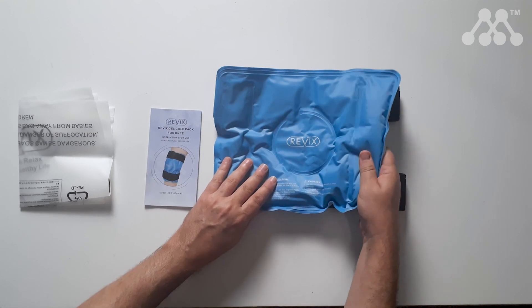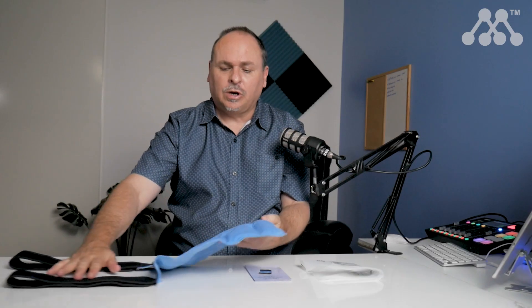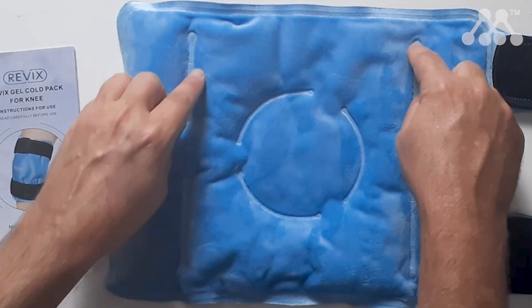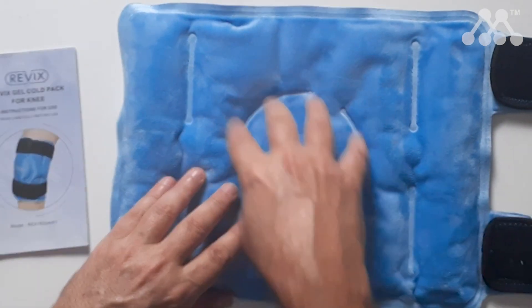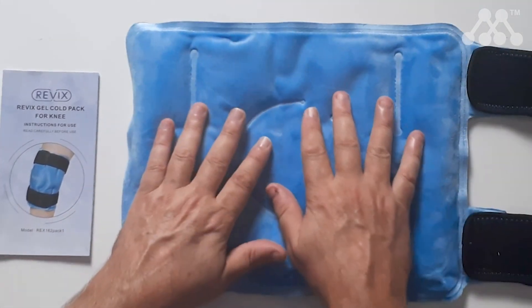It has a nice gel inside, so it's definitely a gel-based cold pack. On the other side, what I really like about it is it has a nice felt feel, which is going to be comfortable on the skin. It also has these embossed areas inside that would conform to the joint that you're trying to secure this to.